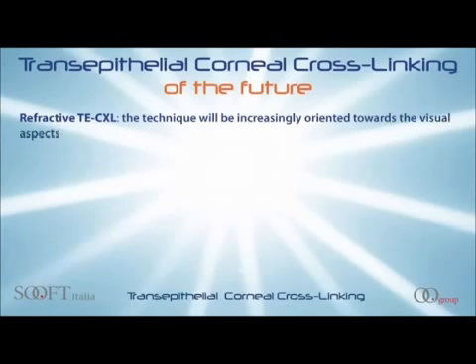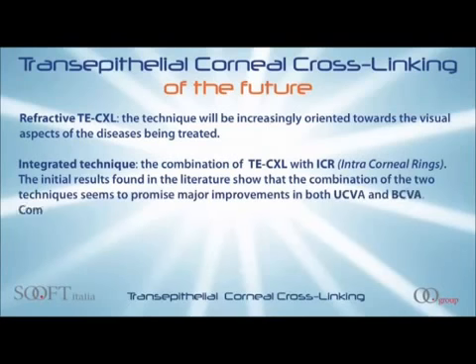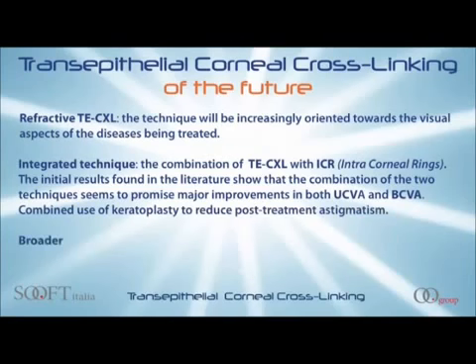Integrated technique. The combination of transepithelial cross-linking with intracorneal rings. The initial results presented in the literature have shown that the combination of these two techniques seems to promise major improvements for both uncorrected visual acuity and best-corrected visual acuity.